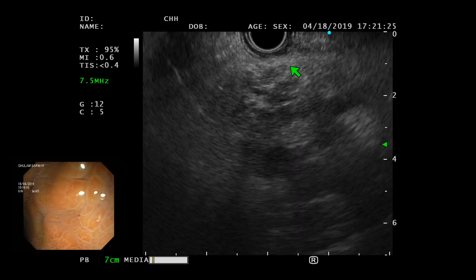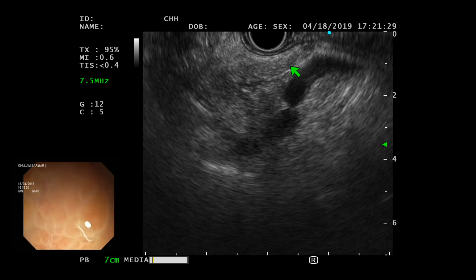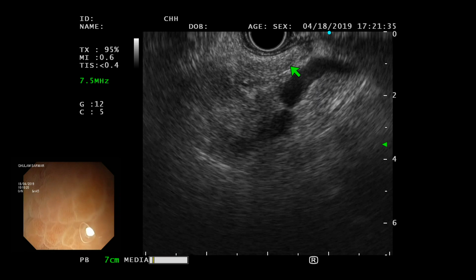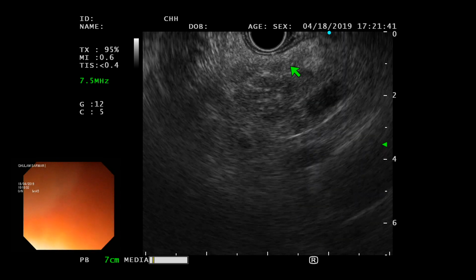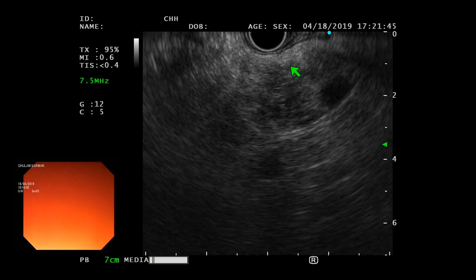No, keep rotating to the right now. You have a pancreas right there. See? You see the splenic artery, you see the splenic vein, but the duct is trying to go to the left of the screen. So you push a little bit. And now keep rotating to the right. If the pancreas falls down, then you need to pull the big wheel towards you. Okay, keep going. Good job.